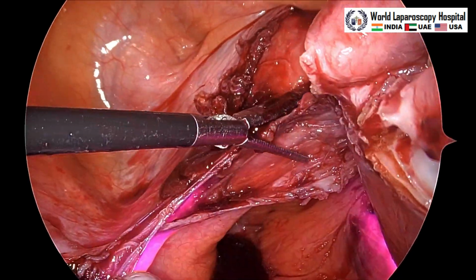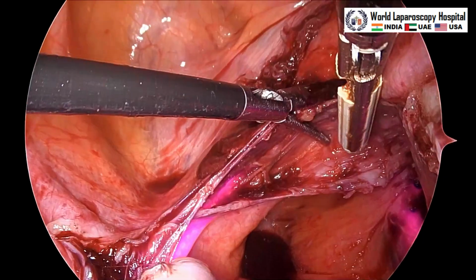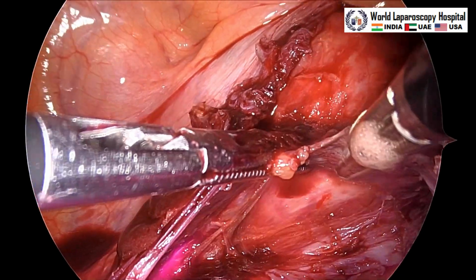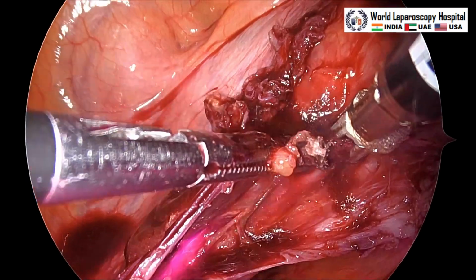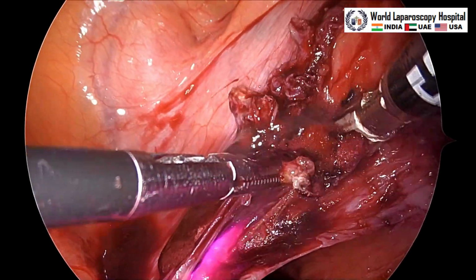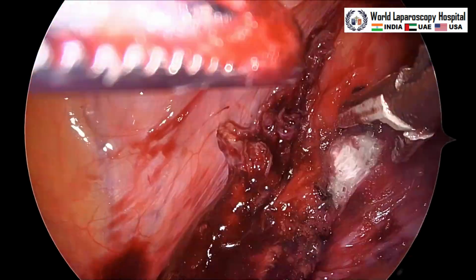Now this is the second attempt. In the second attempt, this time we will coagulate as well as cut. So again the ligature is coagulating and cutting. Again there is a little bit of Mackenrodt's ligament, that also you can coagulate and cut. So the left side is done, and the uterine artery is secured.